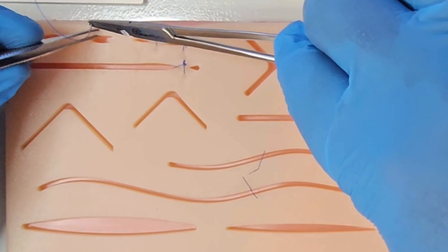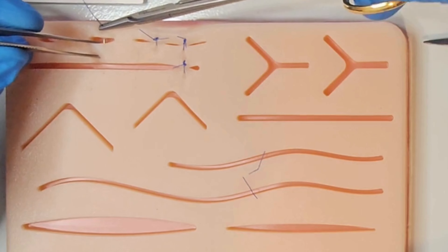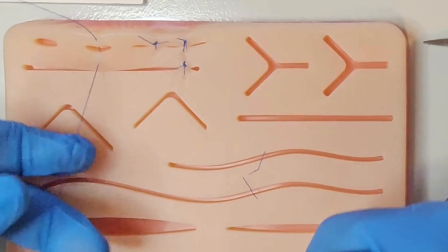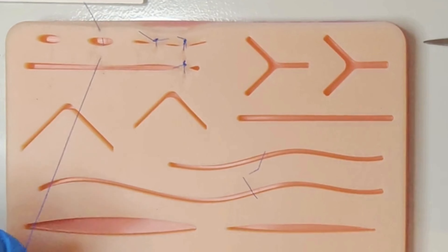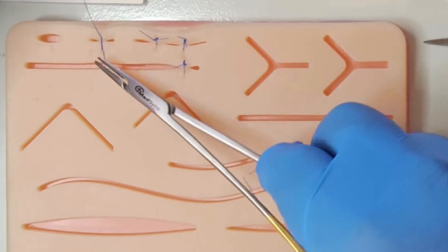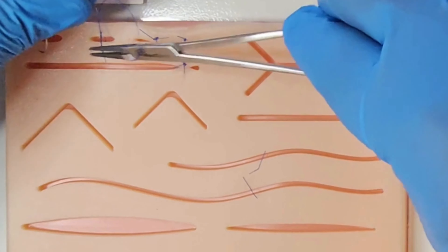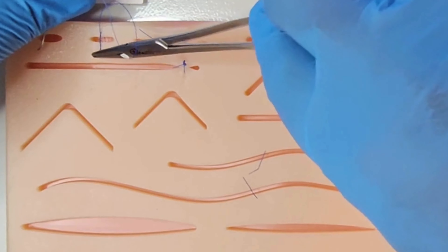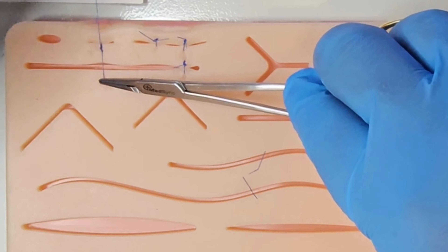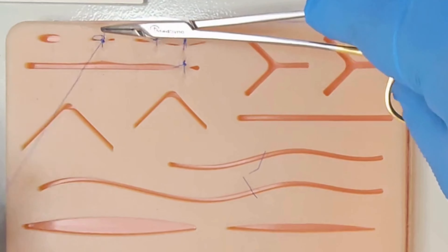You can also perform a slip knot, which is useful when your wound reopens after tying your surgeon's knot. Tie your surgeon's knot; if the wound has reopened, then tie your reef knot, but once you grasp the short end, pull the short end back to where it came from. The wound will re-approximate. You secure the knot by laying your final reef knot.